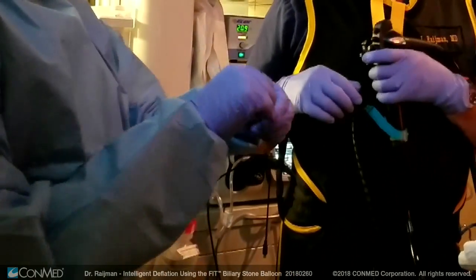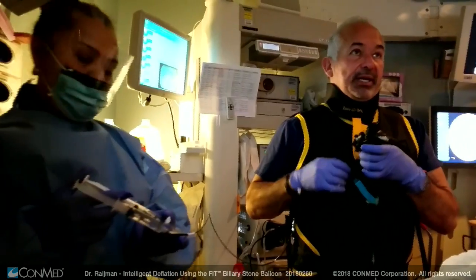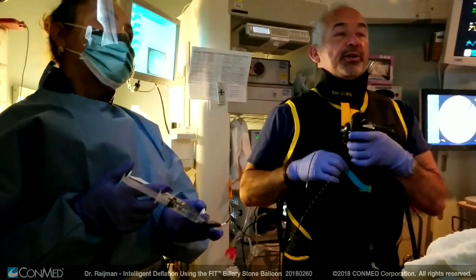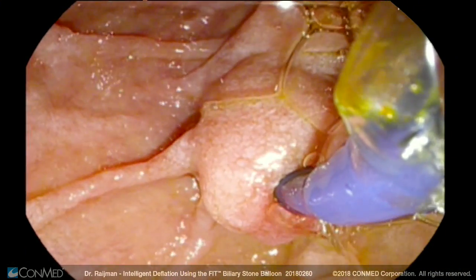We are using a short wire. I am advancing a tapered balloon through the scope and keeping my fingers close to the port because it is a slightly stiffer balloon, which is actually a good thing.